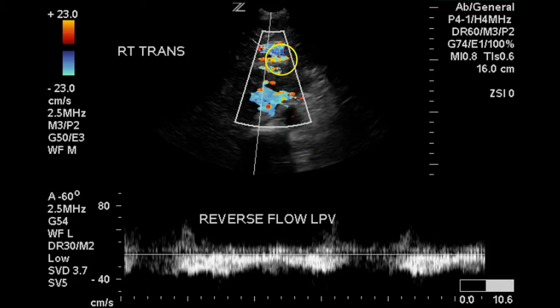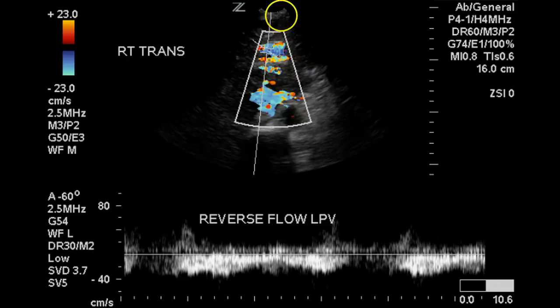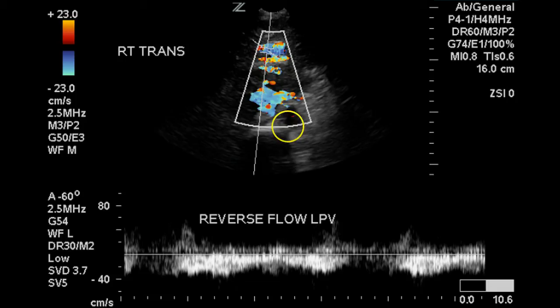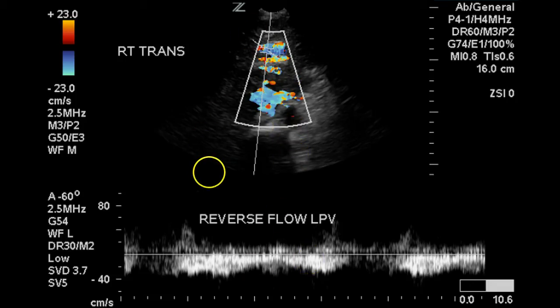This is the Doppler of the left portal vein. We can see that flow is away from the transducer, in an outward direction from the liver. This is abnormal — flow should be toward the top of the screen in this vein.